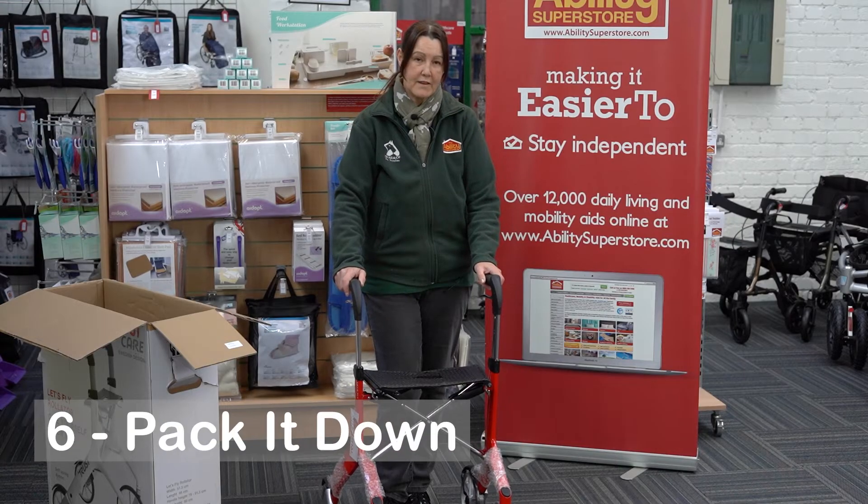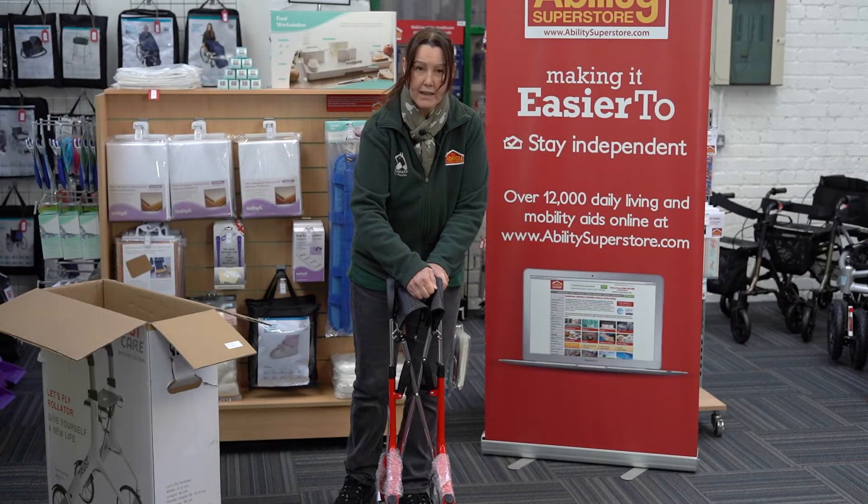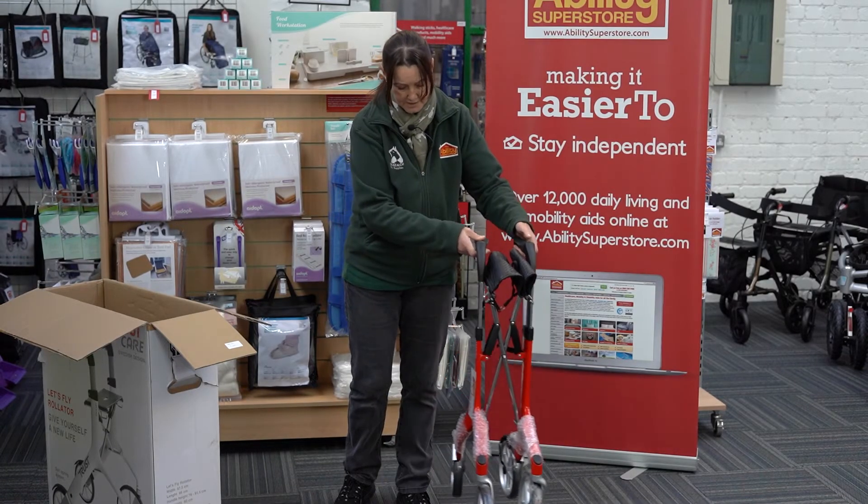When you finish with the Rollator, it's very easy to fold down so you can save a bit of space at home. Simply lift that up, you'll hear it click, and that's it - ready to put away.